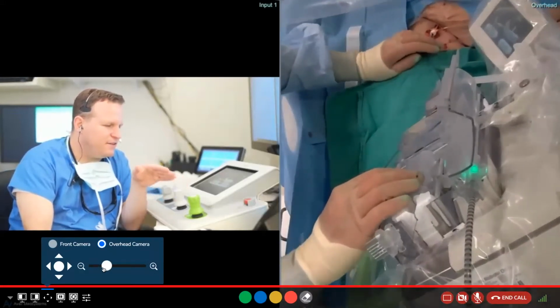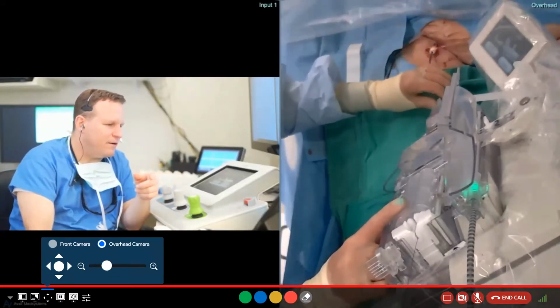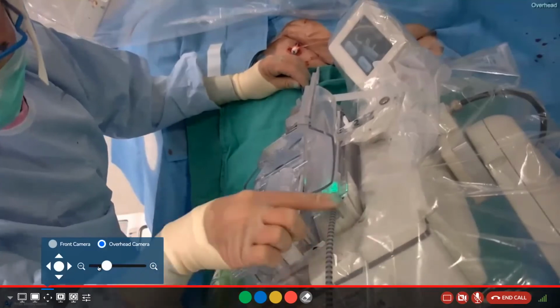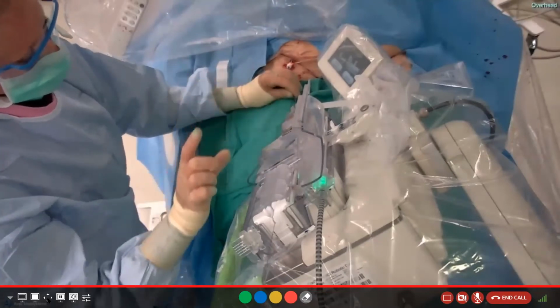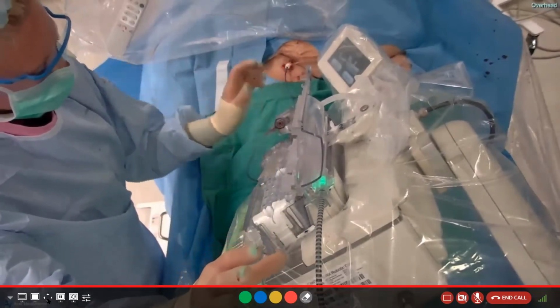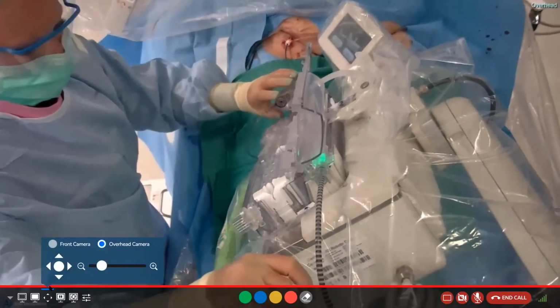What you can see is this is looking down from the robot towards the femoral axis. You can see that there's the guider and the femoral axis. You can raise up a little there. And from there, there's a little tube, and Sam, I wouldn't re-engage it, just for the sake of safety, but there's a tube that goes down over the guider to the sheath. And then you can see where her right hand is. Sam, you want to ease the wire out to show them how the wire goes into it? Yep, you see she's opening up. There are two things there, and you can see the wire. That's the wire right there, and there's a series of gears that turn it and spin it, and also a gear on the back of the sheath that allows us to spin the guider and rotate that as well.